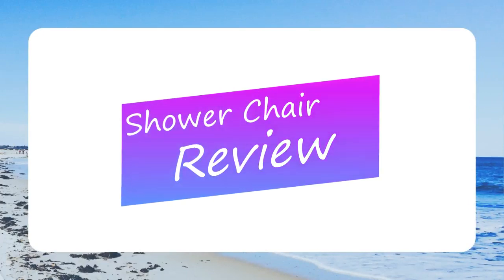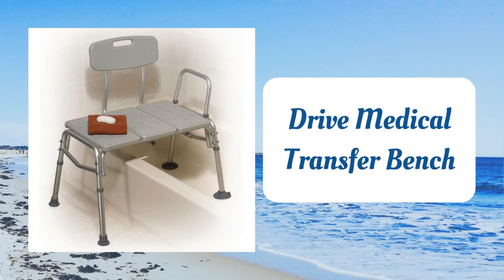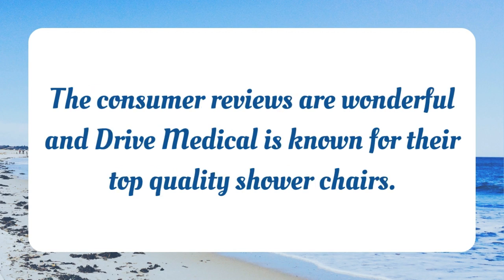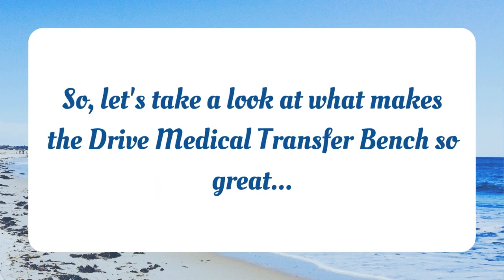Welcome to Shower Chair Review. Today, we're discussing the Drive Medical Transfer Bench. There are many reasons why I selected the Drive Medical Transfer Bench as a daily deal. The consumer reviews are wonderful and Drive Medical is known for their top quality shower chairs. Let's take a look at what makes the Drive Medical Transfer Bench so great.